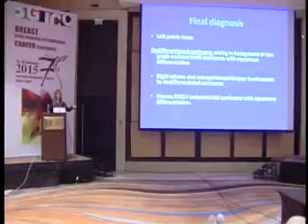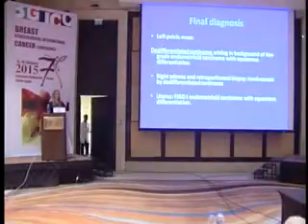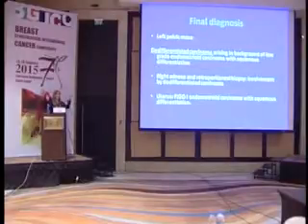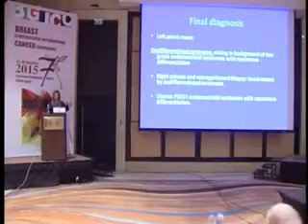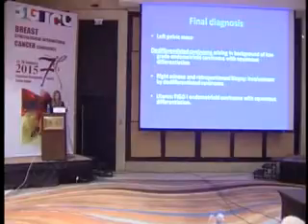The term de-differentiated was described first in soft tissue tumors. Remember the liposarcoma, where the de-differentiated part was. In the Mullerian system, sometimes you might have synchronous malignancy in the uterus and in the ovary, both positive, especially in a background of endometriosis. And apparently the ovary did the de-differentiated part and went crazy. Okay? So this is what we ended up calling it: de-differentiated carcinoma arising in a background of low-grade endometrioid carcinoma with squamous differentiation.